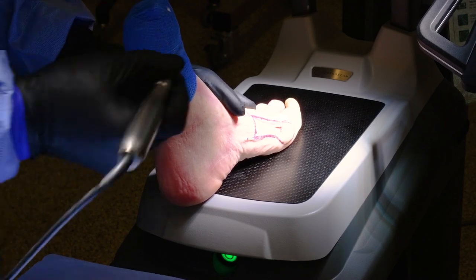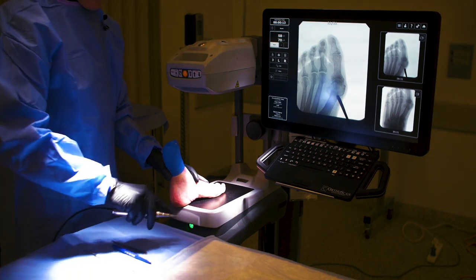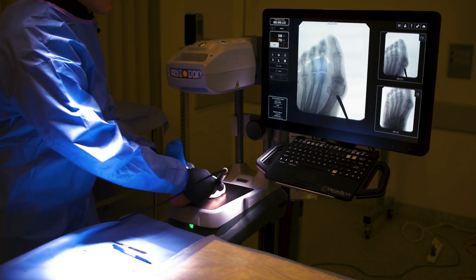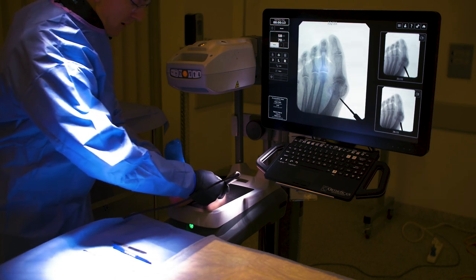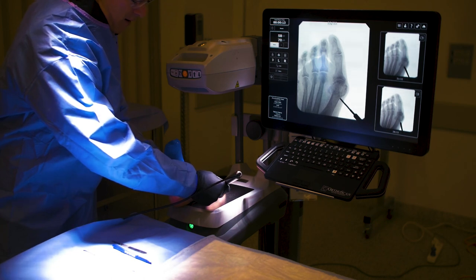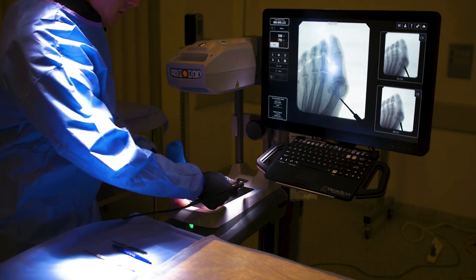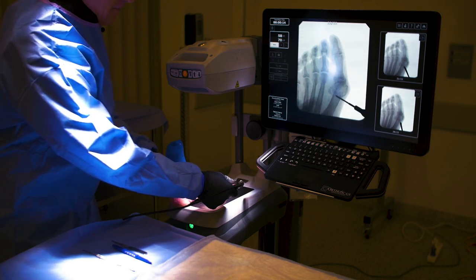This new tool is not like a saw. I hold it either with a pencil grip or a potato peeler grip — either one. I get a new fluoro shot; I'm happy but it's aiming a little bit distal, maybe a little more than I want. You can set it at 6,000 RPM — remember it's low speed, you don't have to have it at 40,000. 6,000 is where we want to go; you don't have to hit the gas.